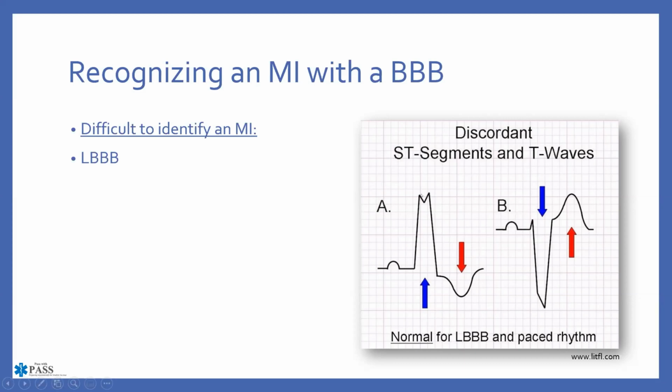If we are looking at A here, what people will often do is they'll see these little peaks up here and they will say, oh, it's a bundle branch block. And oftentimes that may be true, but it isn't always the case. You can end up having something called an RR prime, and it may not end up giving you exactly the information that you think. You think that it is a bundle branch block when in fact it is not. And basically the only way that we're going to be able to do that is to truly just follow your EKG. And in an RR prime, the depolarization is not getting all the way through. So it kind of hangs up for a second and then the message ends up going all the way through. So that is where some of those issues will end up coming in.